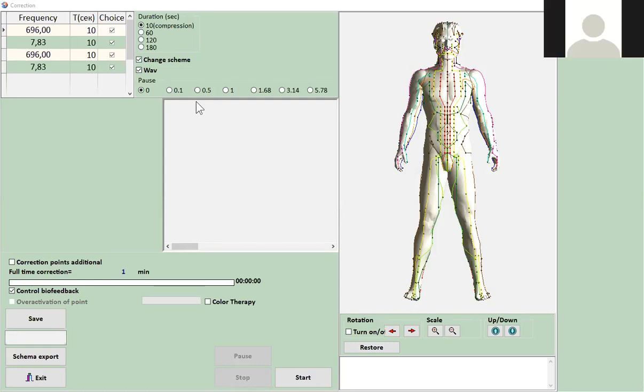So the recording stays on there for multiple days? Yeah, and you have to do a new one every day, because these ferromagnets can be destroyed. That's why you have to do a new one every day. Oh, so that's what I was trying to clarify. In other words, if somebody can't come back every day, they're going to have to wait maybe a week or two before they get a new thing to use. Actually, you can give them 12 of those, until he comes back, and he has to wear them.